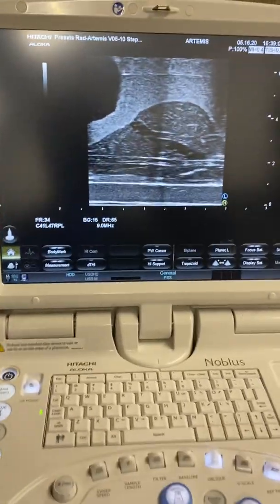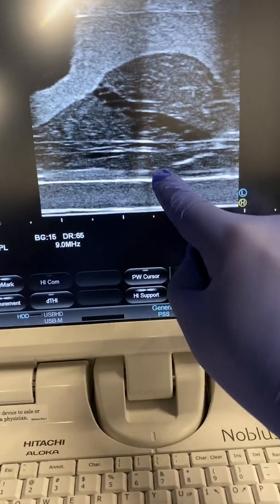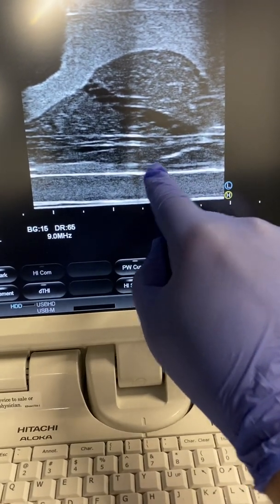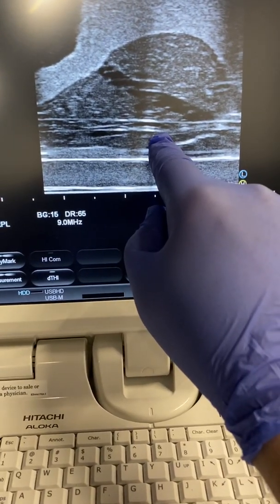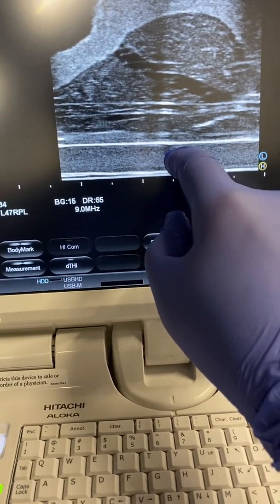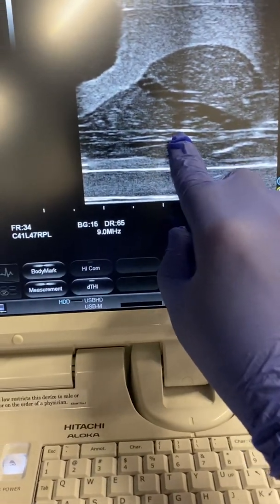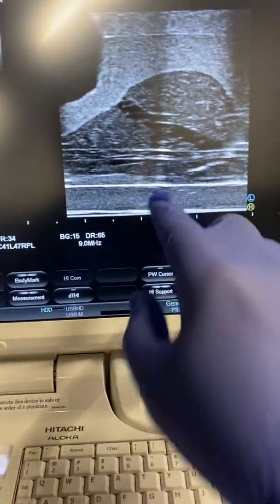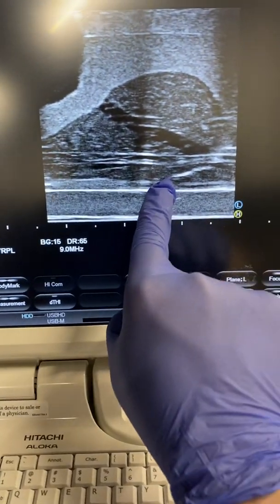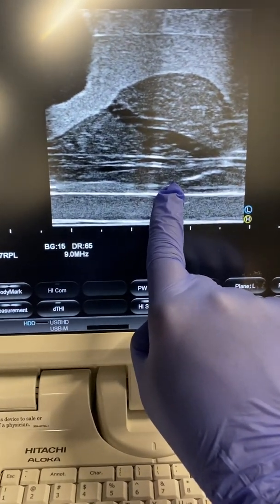They're going to come in on sagittal view initially. Their target is this area at mid-gland, midline - you can see the urethra, right between the prostate and the rectum. They don't want to be in the prostate, and they don't want to be in the rectum - they want to be between them. If they go into the rectum or into the prostate, the gel won't spread properly. Their target is mid-gland, midline, before they inject the SpaceOAR gel.